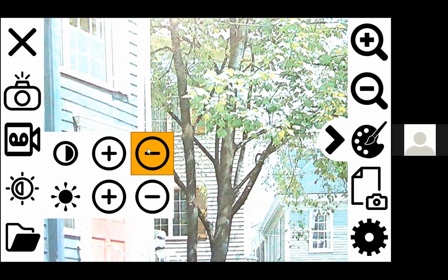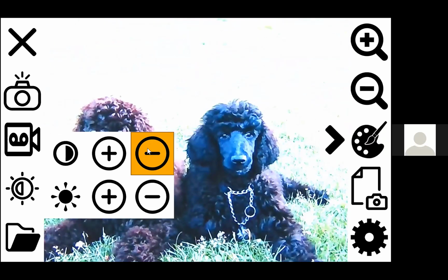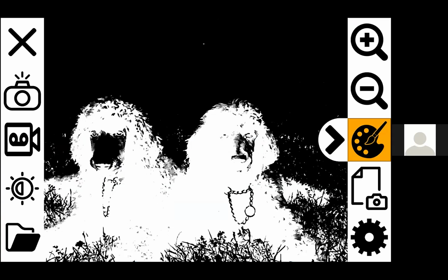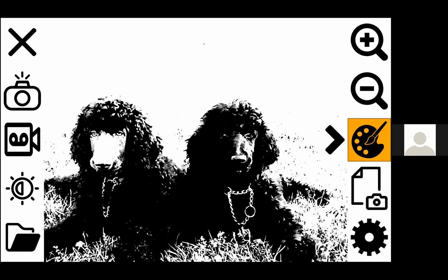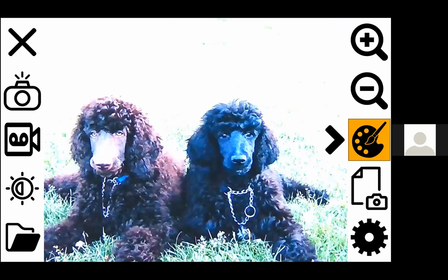So I've got a photo of a house there, but then I've also got just a photo of dogs here. And you'll notice, so I'm going to toggle you through here just to show you. Let me get out of that. And I'm going to toggle you through your colors. So there's obviously a high contrast, black and whites. So here is your natural true color. And then there's your enhanced. So you'll notice it brightens it up a little bit.